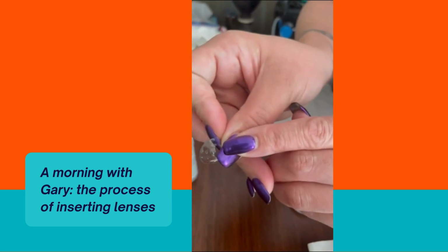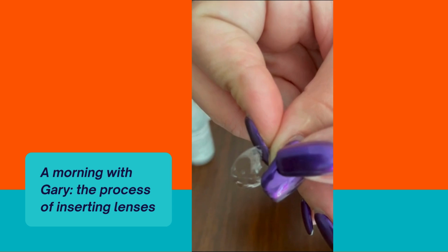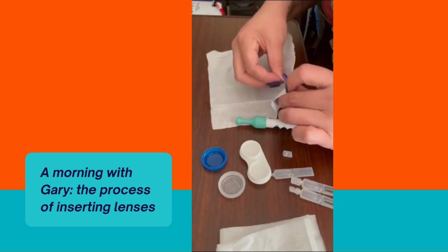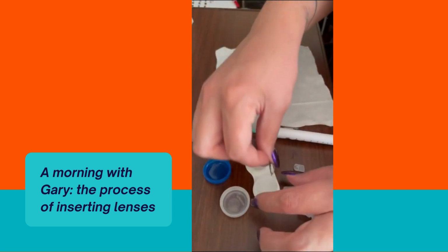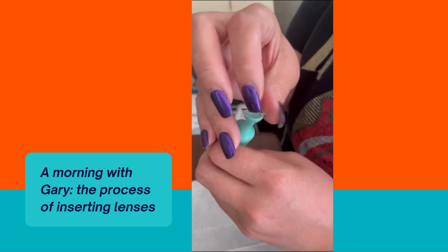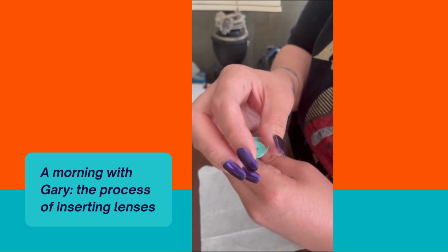Okay, we're going to do the same with the left eye. Look here, the left eye has 2 dots, and that's how we indicate where the contact needs to lay, and also the fact that it's a left eye, 2 dots. So just a small wipe to make sure we don't have anything on it. Back in the solution. And then the exact same thing. We're going to place it on the dropper, and we're going to turn so that our dots are on the top.